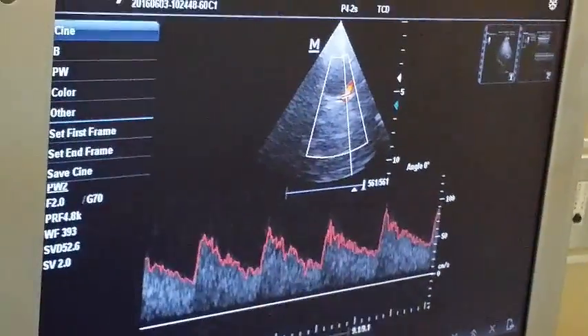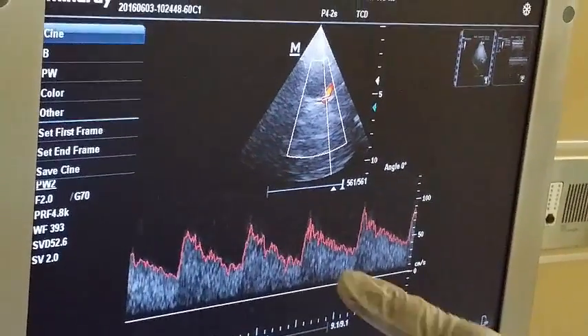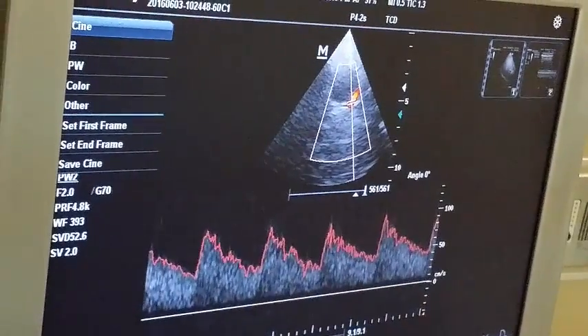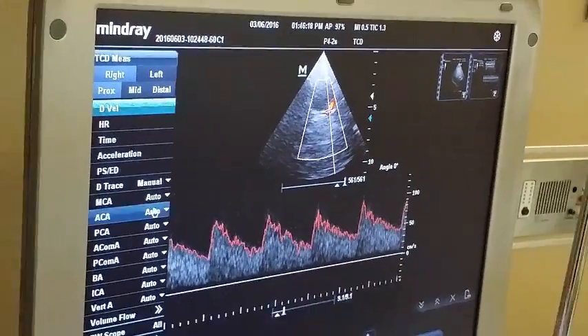As you know, cerebral circulation is a low resistance circulation, so you will get the diastolic flow here — the flow in diastole is almost 50% of the systole, which is amazing because the brain needs blood in both systole and diastole.